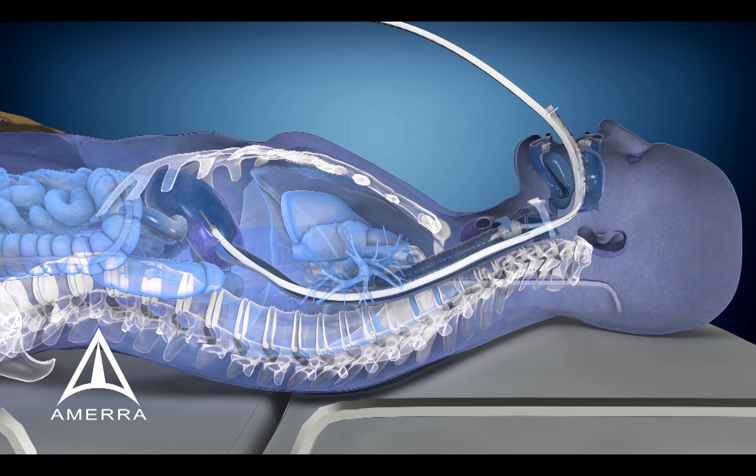The esophageal cooling device is a fast, easy, safe, and cost-effective solution for patient temperature modulation.